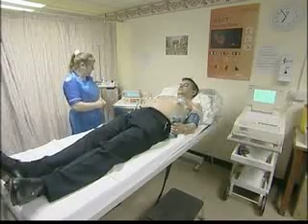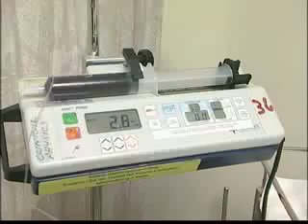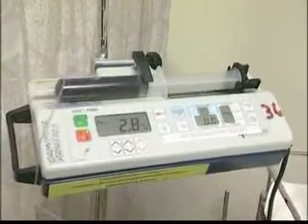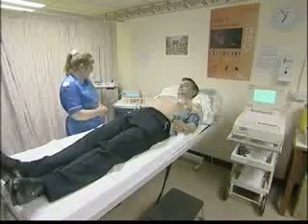Stressing of the heart is achieved in two ways: first by a pharmaceutical which has a similar effect on the heart to taking exercise, and also by squeezing a dumbbell.